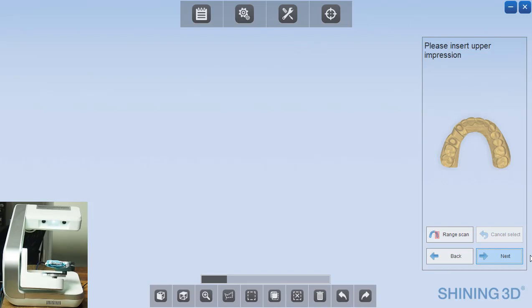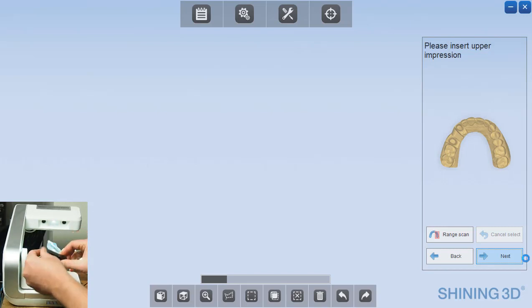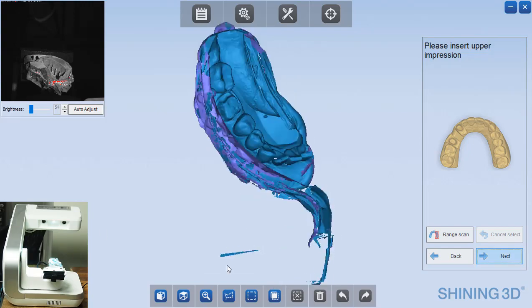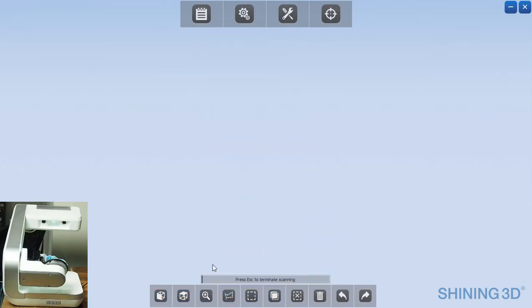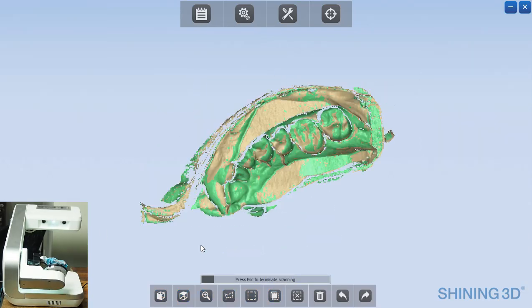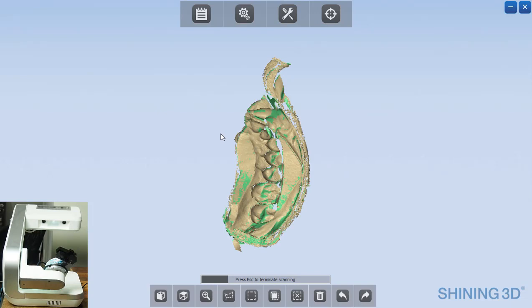Once that's complete, click next. And now the software will ask you to flip the impression over for the upper impression. So I've flipped that over and now I can click next. And the software is going to lead through the same automated capture of the data on this opposing side.